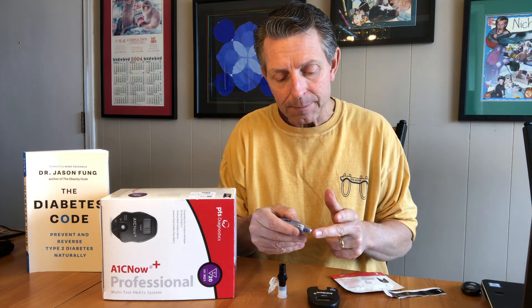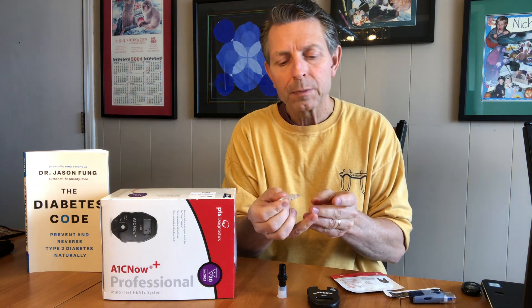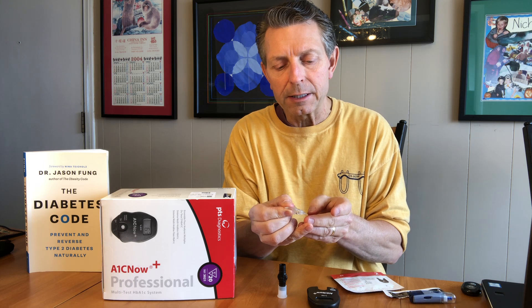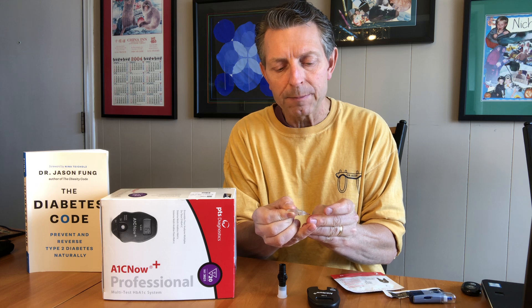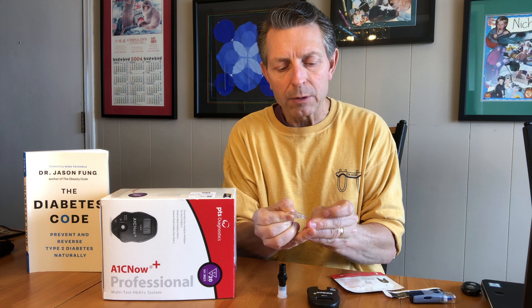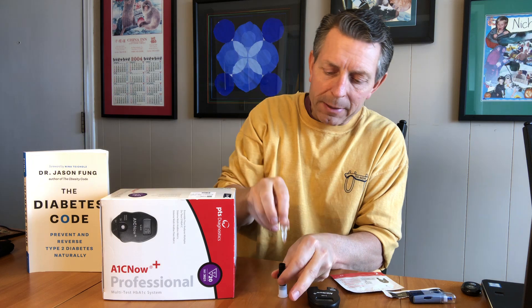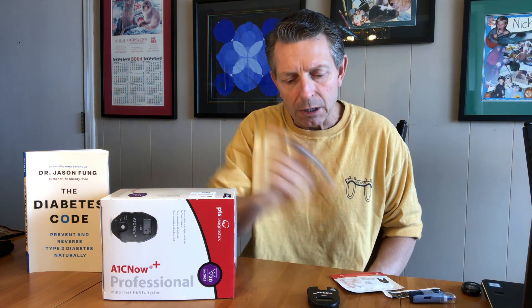Take the lancet and go ahead and give your finger a little micro-poke — it really doesn't take a lot. We get just a little bit of blood. There's a small suction device in here, and this whole tube will fill up very nicely with the sample specimen. We want to fill it up completely, and you'll see the red blood filled up on the end. Then we push this down into the sampling device and shake it with the reagent about six to eight times — that's really all we need to do.